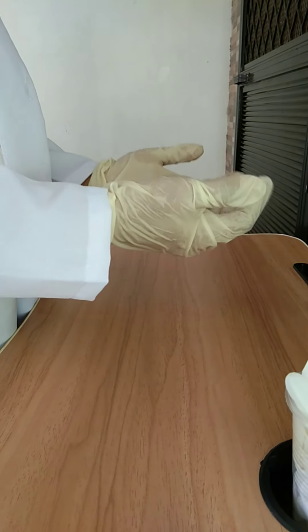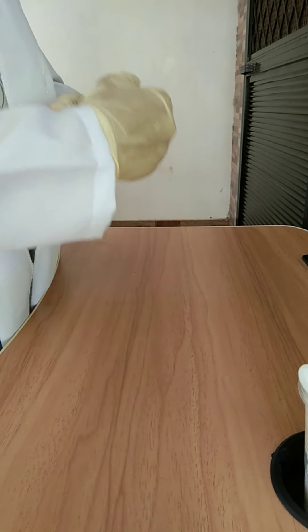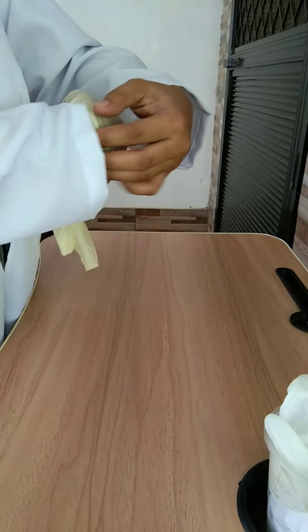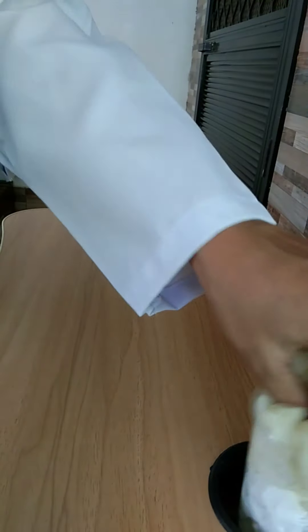Glove removal: to remove, grasp one glove at the heel of the hand with the other gloved hand and peel off the glove, holding it in the palm of the gloved hand. Push under the cuff of the remaining glove with one or two ungloved fingers and peel off the other glove. Discard the gloves and perform hand hygiene.